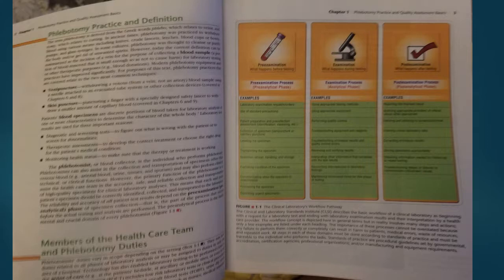However, today, the current definition can be summarized as the incision of a vein for the purpose of collecting a blood sample, a portion of blood removed that is small enough so as not to cause harm, for laboratory testing or other therapeutic purposes, such as blood donations. Modern phlebotomy equipment and practice have improved significantly.